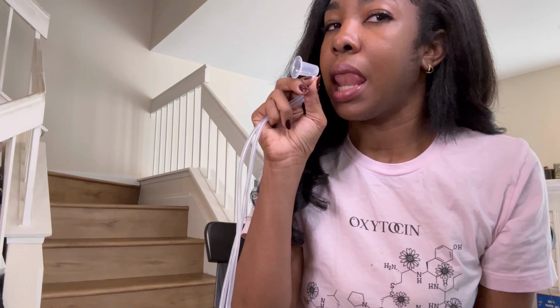So you can see here, it says CRT. That does not stand for critical race theory. It stands for correct on this machine, and the correcting mode is for flat or retracted or inverted nipples. You can hear it's moderately noisy. It's not super noisy. You can't hear it over me talking, so that's a good sign. So we've got it on the correct mode, and this is for flat or inverted nipples.